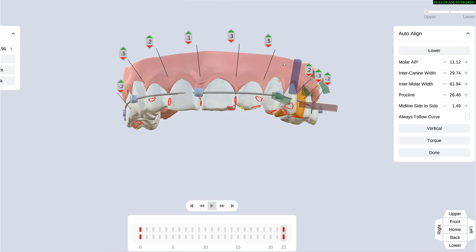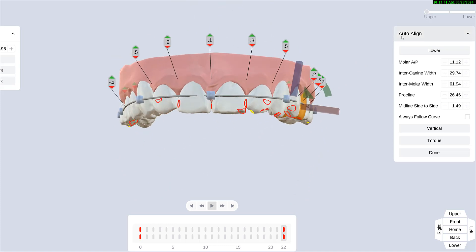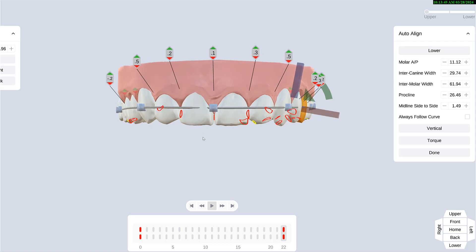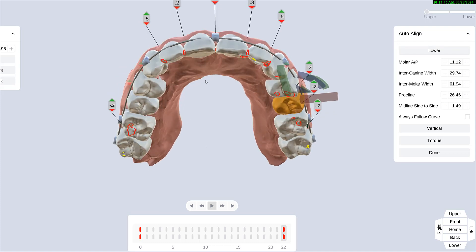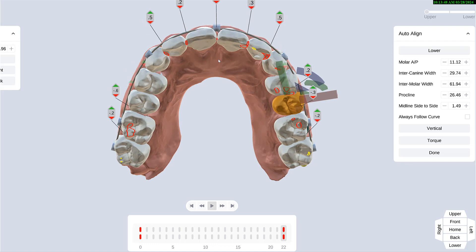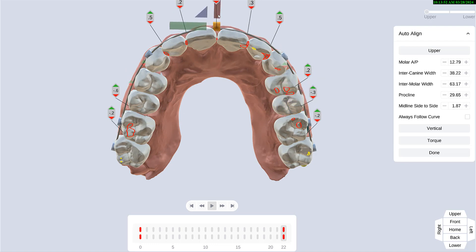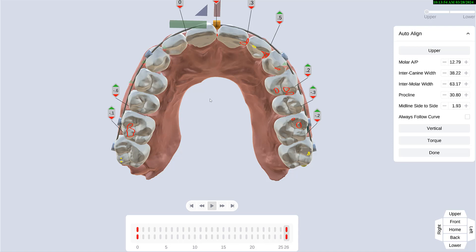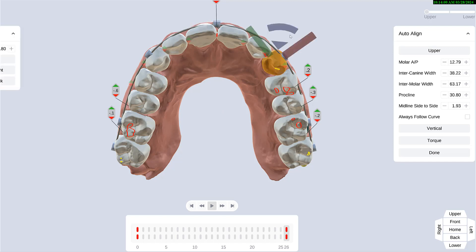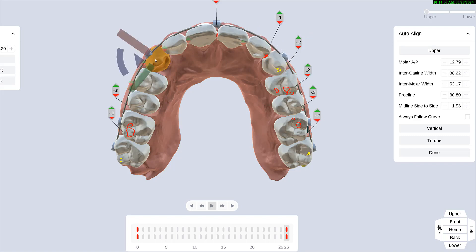So that's the auto-align system from ArchForm. Quite a few companies now offer this and it will get better. You can also decide to push the teeth more forward and everything will align. It's a really nice concept and it will save you a ton of time in designing your cases. Thank you.